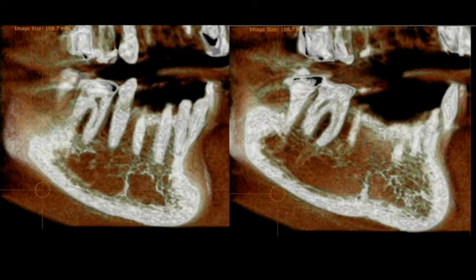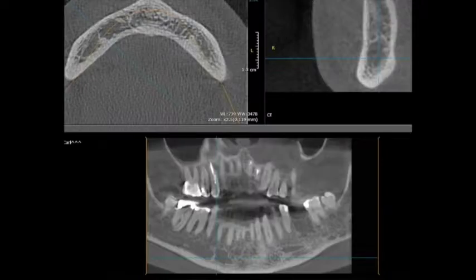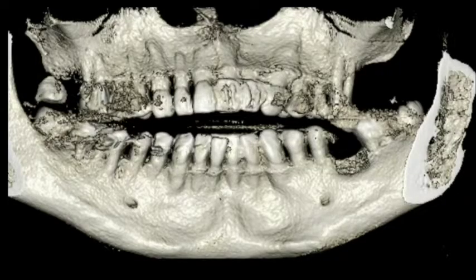I think the approach that I saw this morning, looking at the inflammatory mediators and the immunologic responses and the cytokines, is the way to do it. But do you have to surgerize, or can you get it out some other way? Well, that area that I was looking at when I did the 3D rendering was just a prominent mentum and very deep fossa. This patient had absolutely no complaints. So this is a confound.